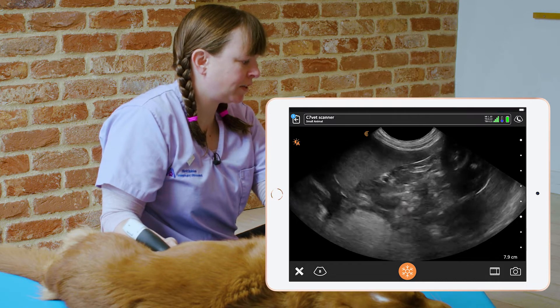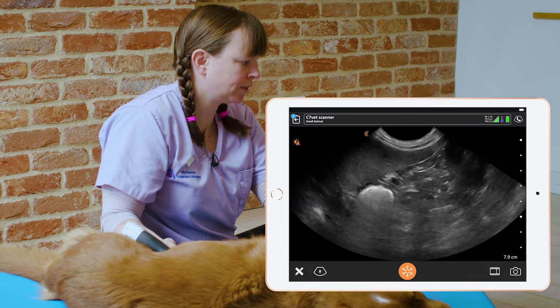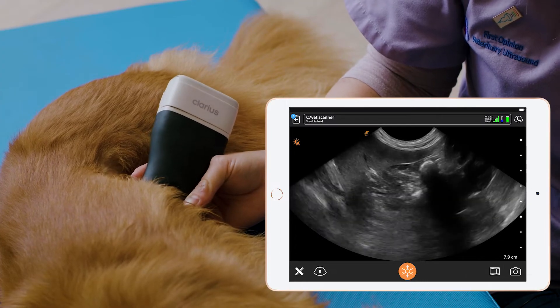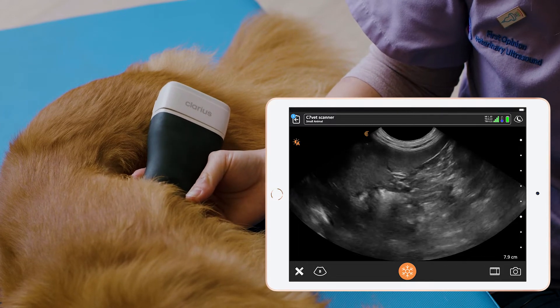The left limb of the pancreas is isoechoic and not very long in the dog, so it can be very hard to spot. But once we've fanned in this area and we haven't seen any abnormalities, we can be sure that the left limb of the pancreas is normal.